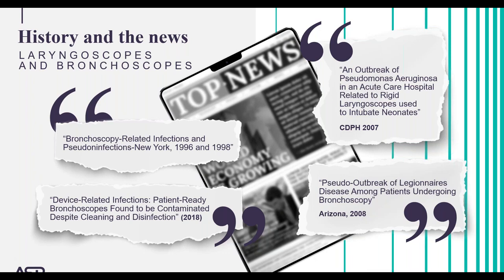This event and others changed the recommendation for reprocessing laryngoscope blades and handles by the California Department of Health, and eventually throughout many other states in the country. So when you look at the slide, you might be thinking, well, these happened a long time ago. But Reggie, a little later in the presentation, is going to go over a 2018 study by Corey Ofsted that really highlights that there's still some problems out there.